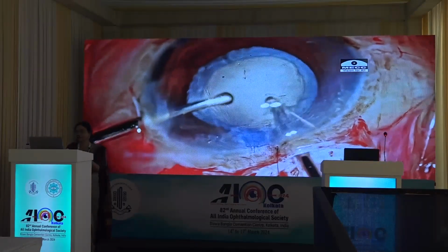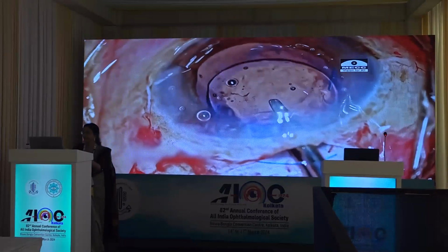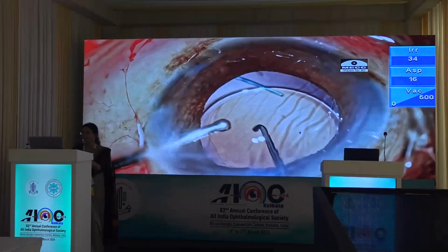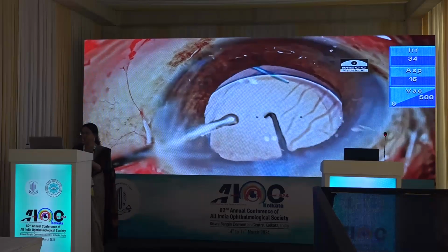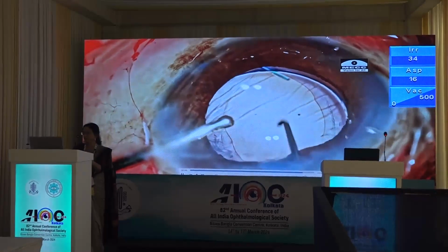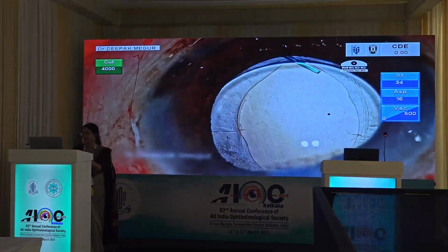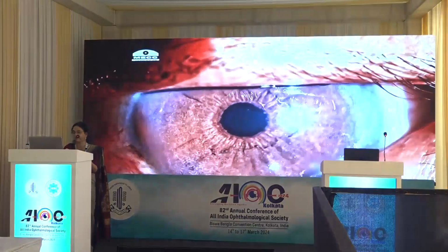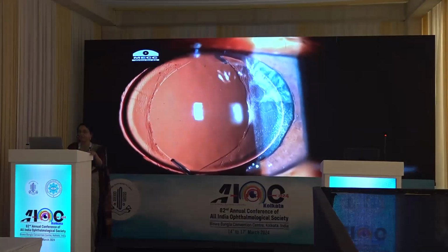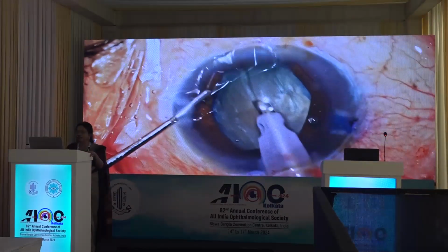Generally, the vitreous shows a tendency to prolapse towards the main wound, and that is where you need to be meticulous about your anterior vitrectomy. A multi-piece IOL is being implanted in the sulcus with the optic capture. So optic capture generally ensures long-term stability of the IOL. In the post-op, the patient was finally doing well. Ovalization of the rhexis margin indicates optic capture.